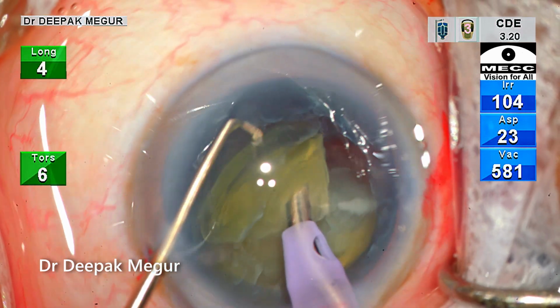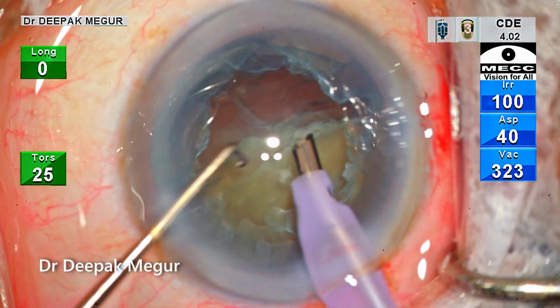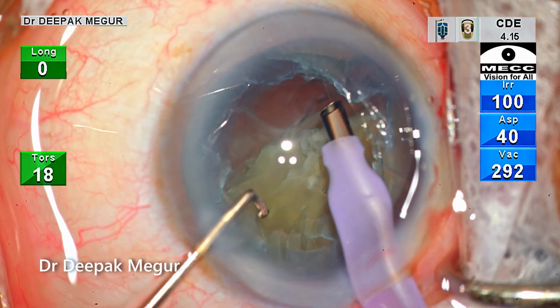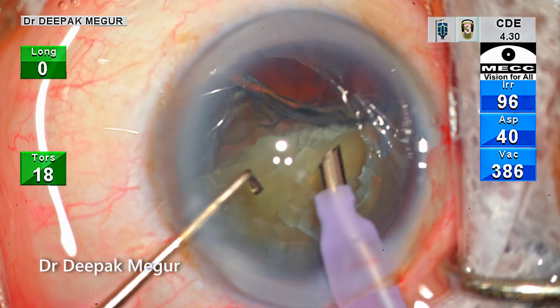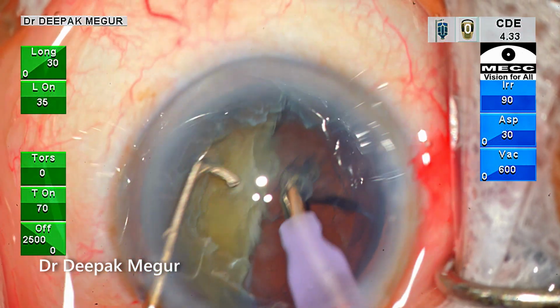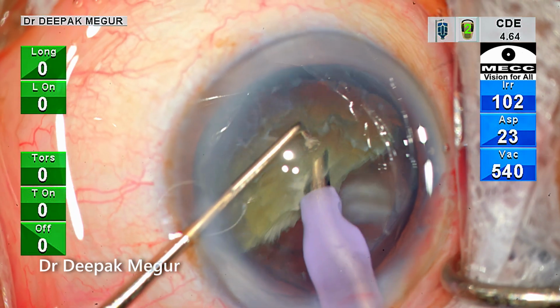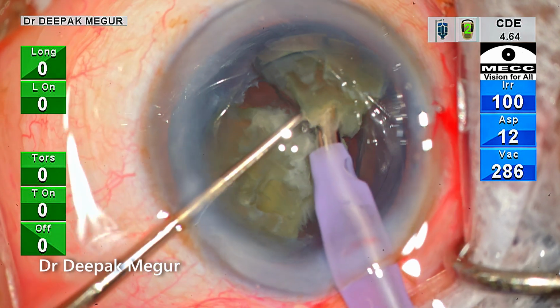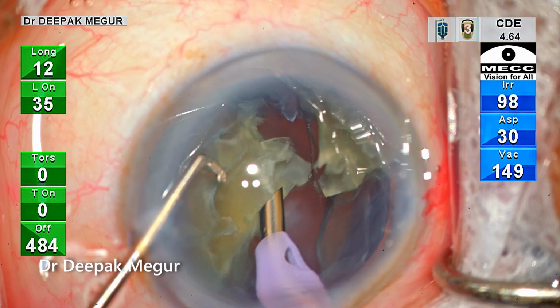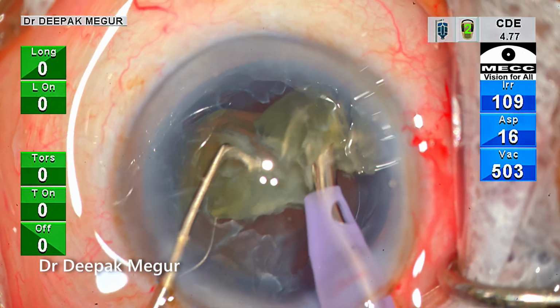Again, you can just pull the nucleus fragment, chopped and emulsified. I'm just trying to trim a little bit of epinucleus here. The nucleus is rotated. The second heminucleus is relatively much easier to chop because you can pull it and see the equator and then pass the chopper beyond it and then crack it. So the horizontal chopping technique is extremely efficient and physiological.